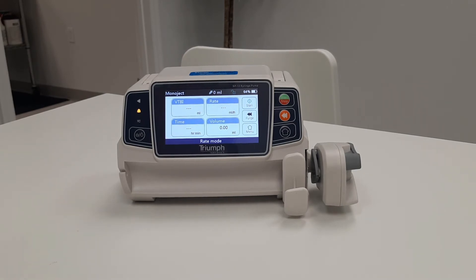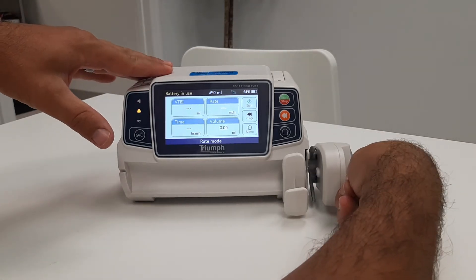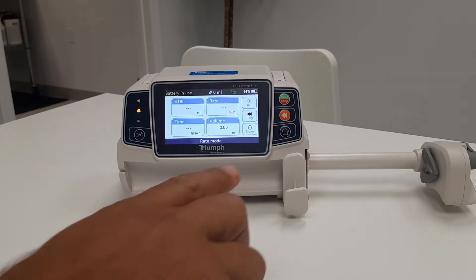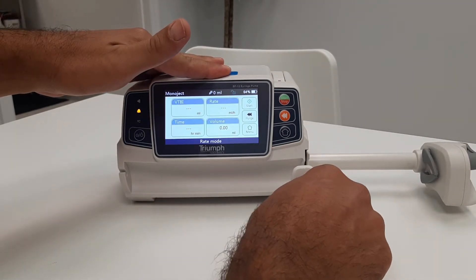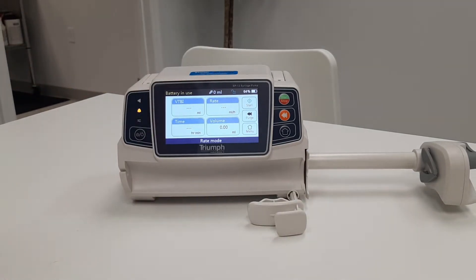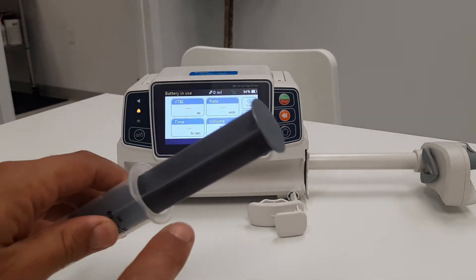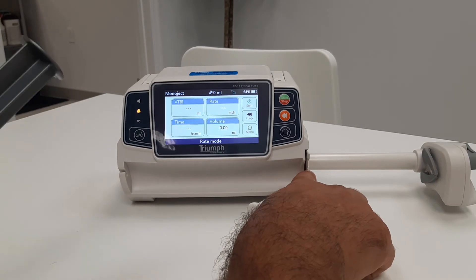At this point, install the syringe by first depressing the plunger handle and extending the arm all the way out. Second, pull the barrel clamp out and rotate it clockwise or counterclockwise to engage. Next, install the syringe, ensuring the flange of the syringe is seated all the way in the flange holder.